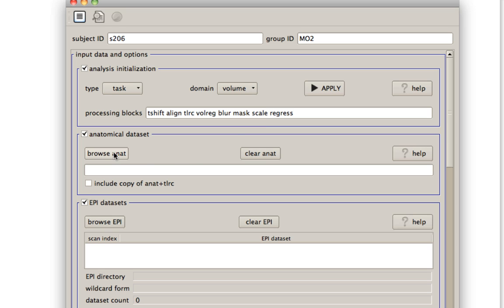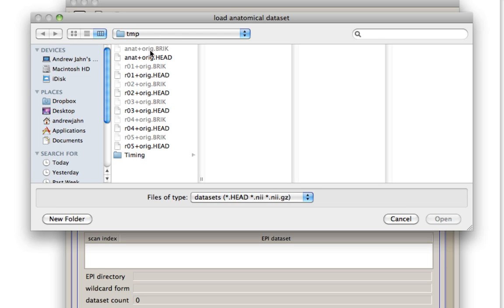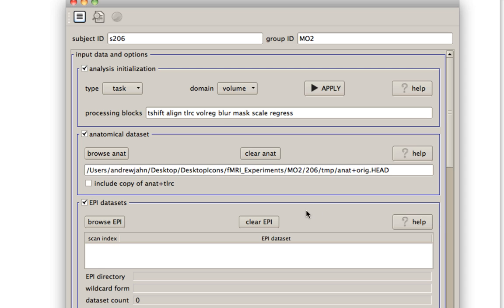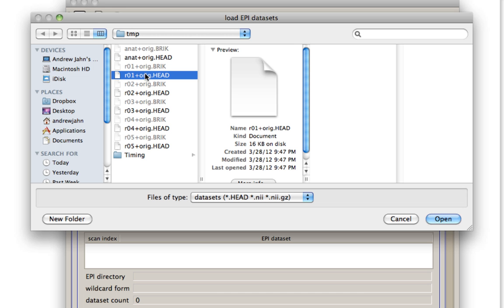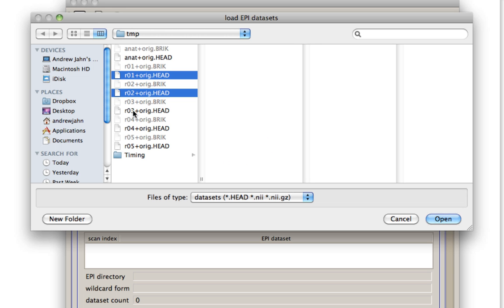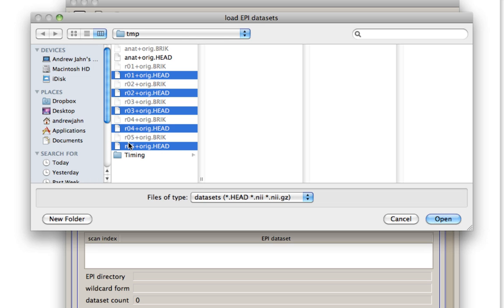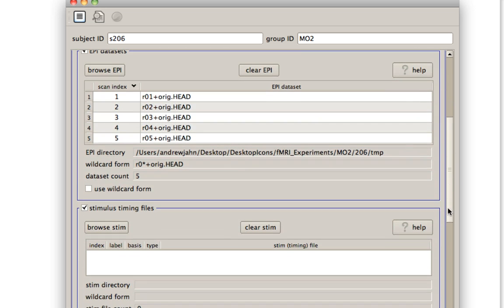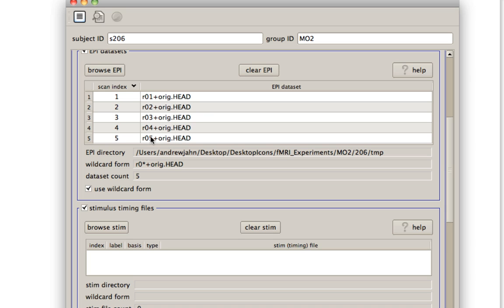First things first, we're going to populate this with our anatomical dataset. Here in this directory, I have it specified as ANAT plus orig. And also our EPI datasets. I'm going to select all five runs here. If you've zero padded them, that is if you've included one zero before each number, then you can go ahead and specify this use wildcard form. It tries to detect what is the only thing that is different between all these different datasets. So if you've formatted them with zero padding, you're able to use the wildcard form.